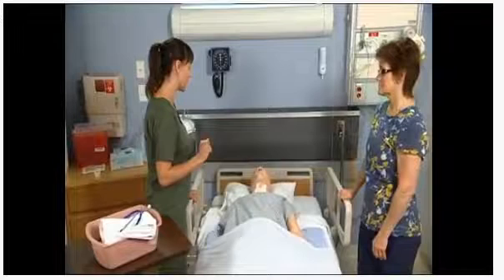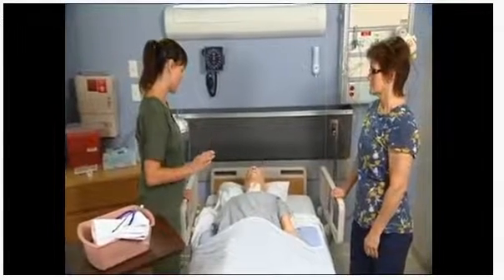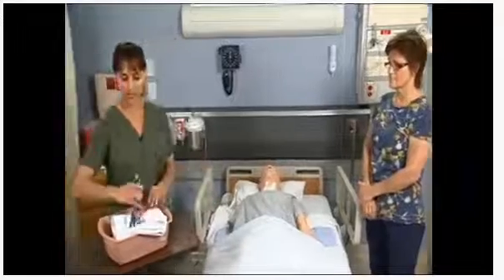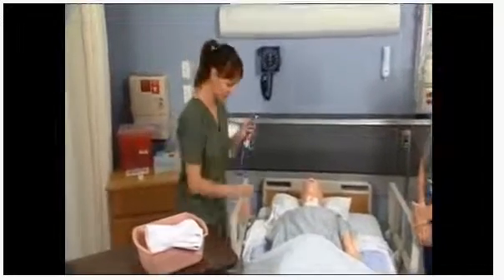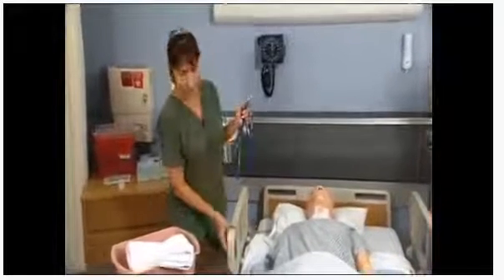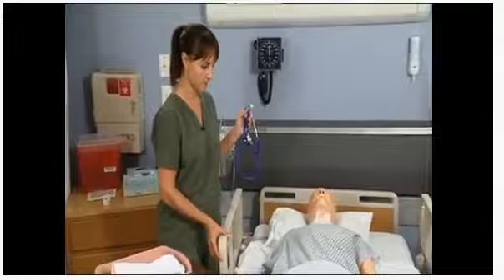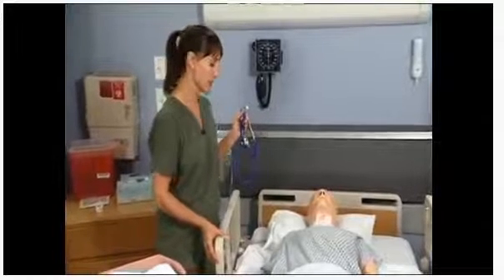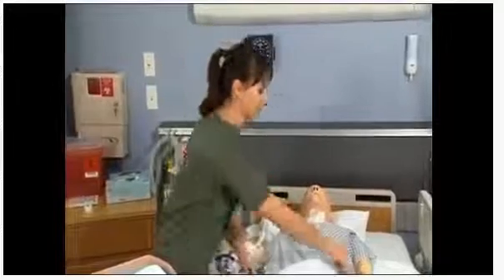Okay, what I need to do first, Mrs. Jones, is I'm just going to go ahead and kind of just listen to your abdomen and do an assessment, okay? At this time, I just want to go ahead and get a baseline, and so I need to listen to her bowel sounds. Again, I want to make sure that I raise the bed up to my working level. During the procedure, I'm going to go over everything with you, step by step, okay?